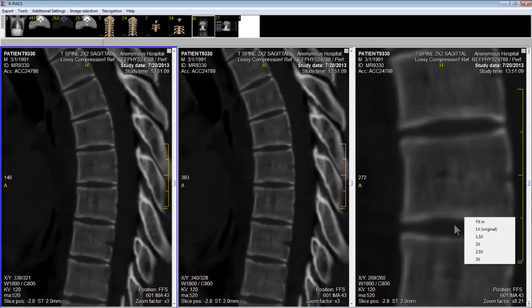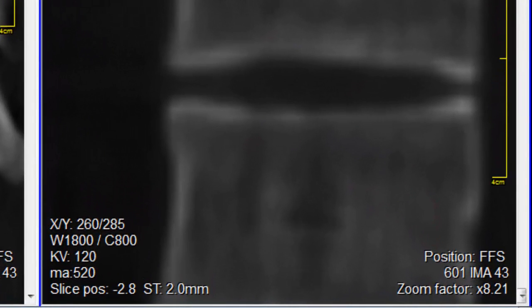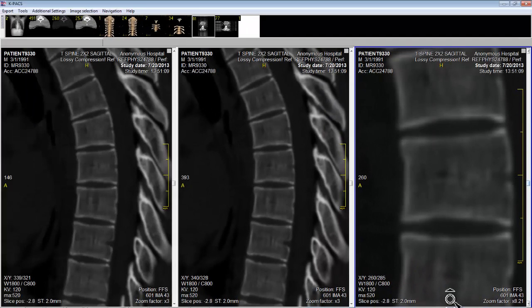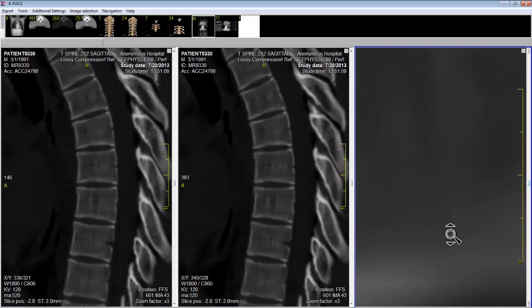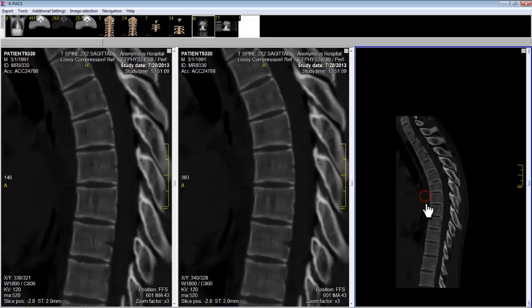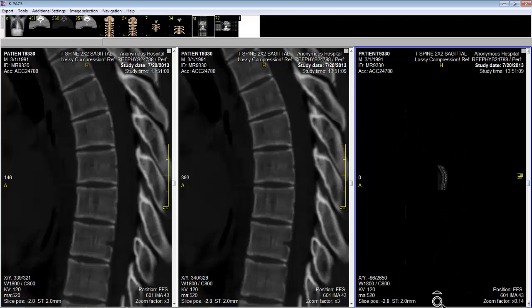To get different magnifications besides the preset values, I move my cursor to the bottom of the screen until it looks like a circle or a magnifying glass with two arrows. If I left click, hold the clicker down, and move up, the image gets much larger. If I go down keeping the clicker down, the image gets much smaller. In fact I can make this image very very small so you can almost not see it.